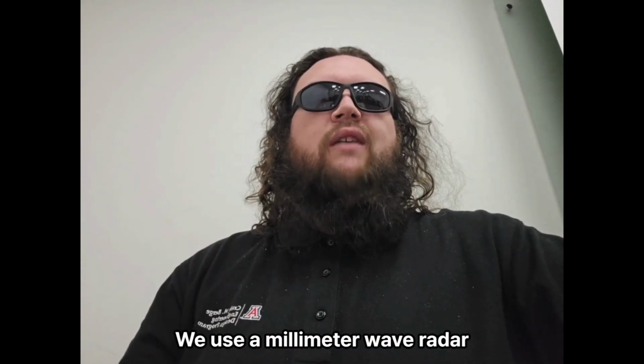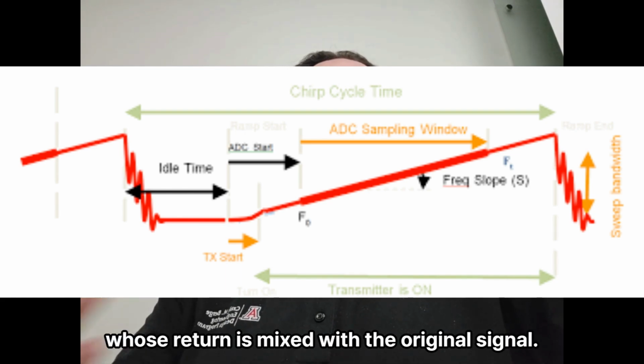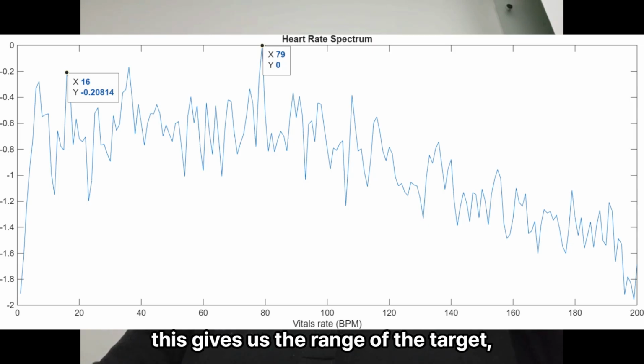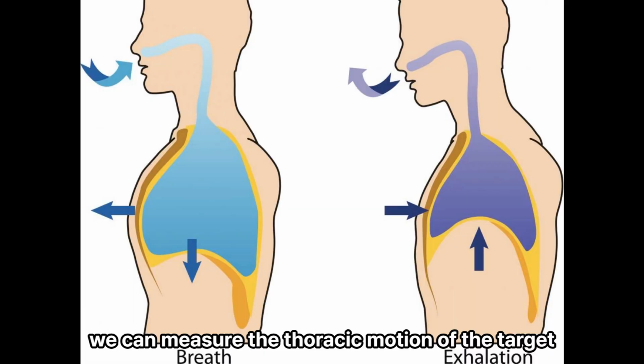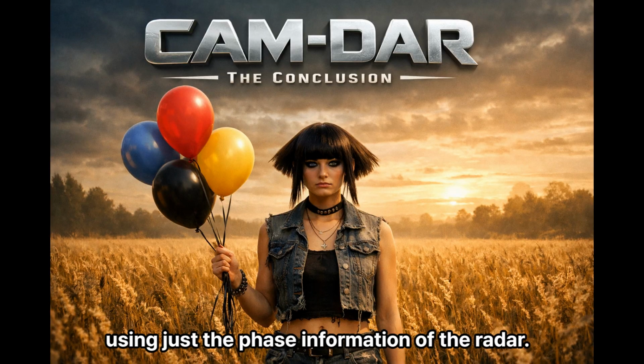We use a millimeter wave radar that emits a series of linear chirps whose return is mixed with the original signal. Over the short time frame within one chirp, this gives us the range of the target, and over the longer time frames between multiple chirps, we can measure the thoracic motion of the target using just the phase information of the radar.